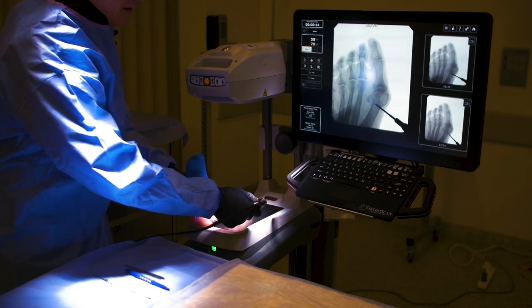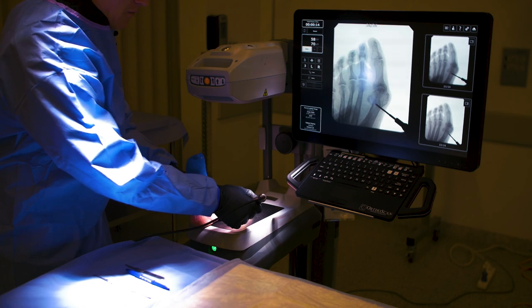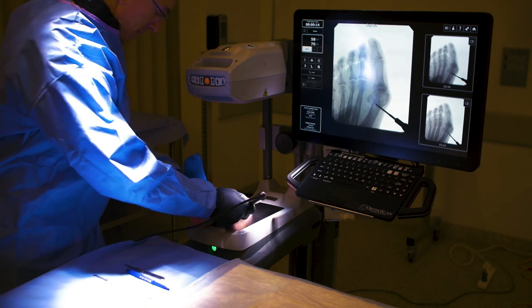I'm perpendicular to maybe 10 degrees distal and I'm going to aim down a little bit. Why down? You're going to lose a couple millimeters of bone when you do any osteotomy, so if I translate a little bit plantar I'm going to decrease the risk of transfer metatarsalgia.